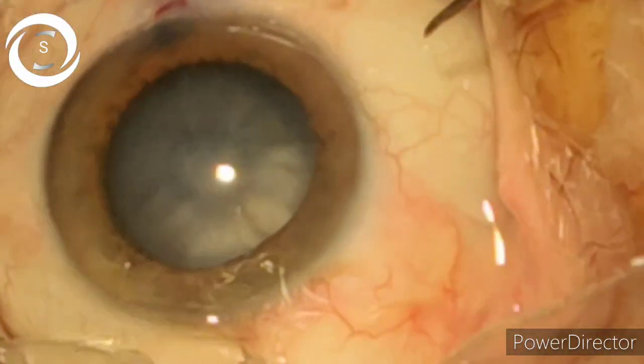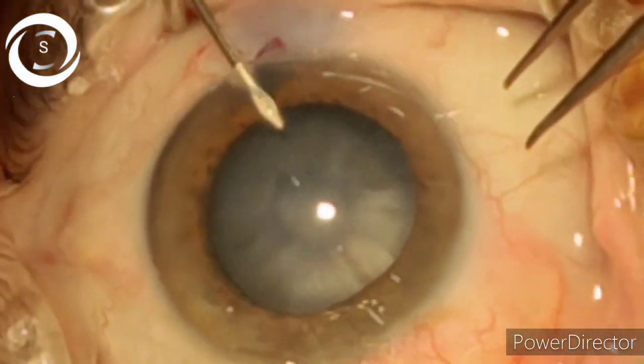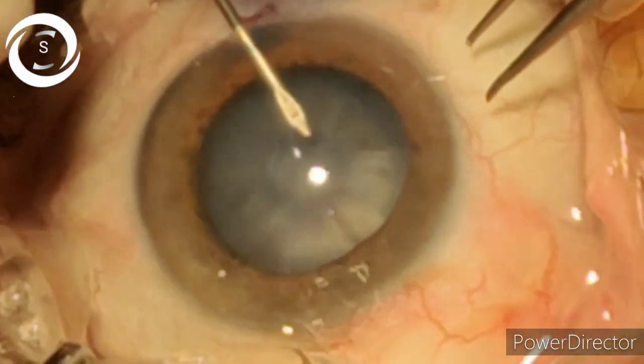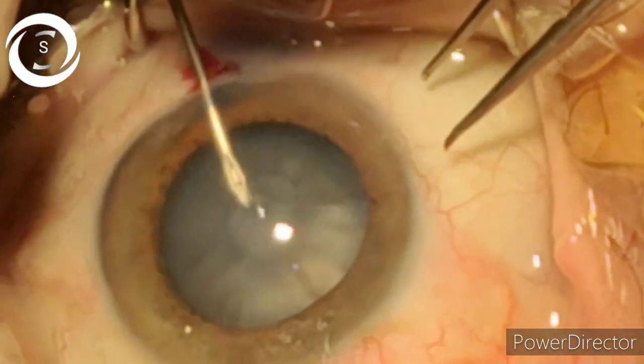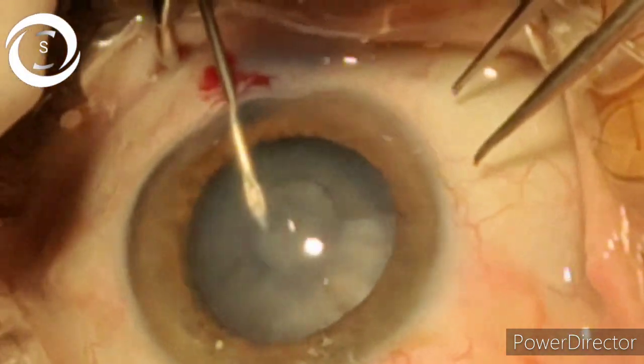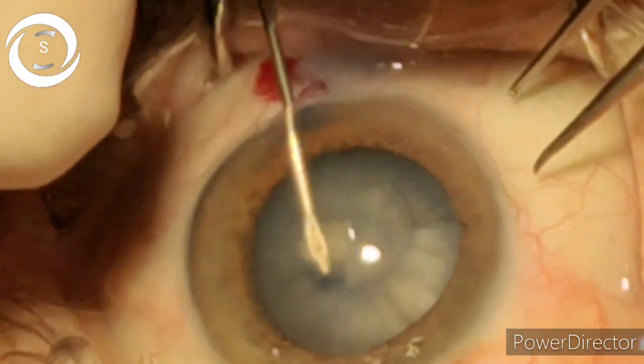Today in this video I will show you the ideal technique of doing capsulorhexis in a hard mature cataract with raised intracapsular pressure, in which if you perform the routine technique, the chances of the rhexis going radial are increased.